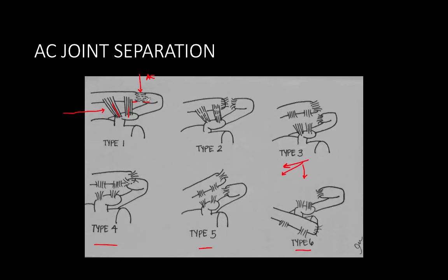Remember, we always look at the undersurface of the clavicle up against the undersurface of the acromion. So grade 1 AC joint separations generally have no findings. Maybe you can see a little widening of the joint space. They'll definitely be clinically symptomatic. But if you see a normal radiograph, it does not rule out a type 1 injury. Remember, weighting is always useful. You distract the shoulder with a second view and see if a misalignment appears.